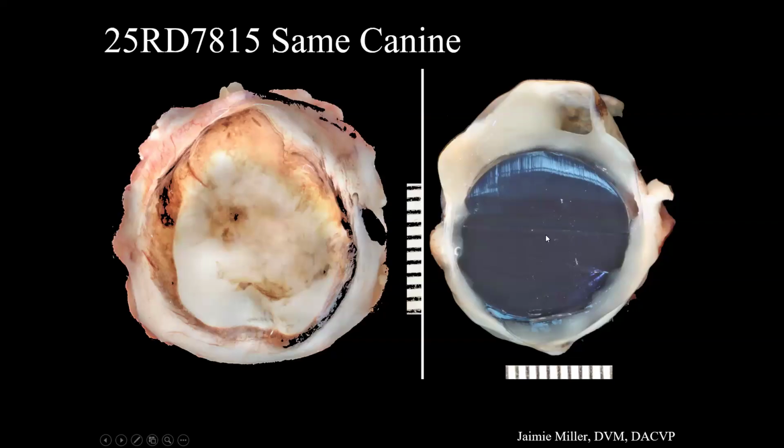The globe is very firm on palpation when handling grossly. And then the other thing that we note in and around this prosthesis and in this chamber here is this milky, opaque material that fills the rest of the globe. So we will take a look at that.